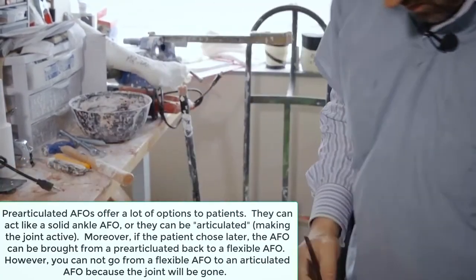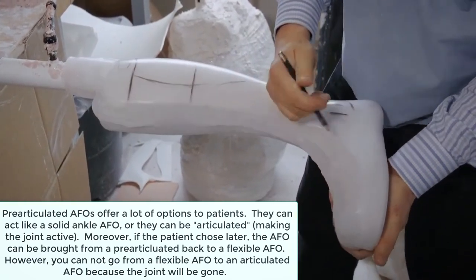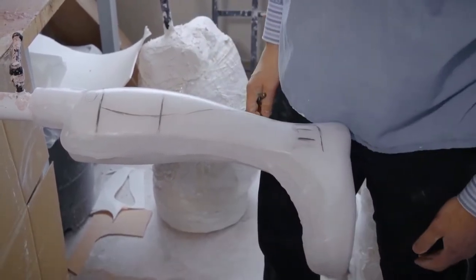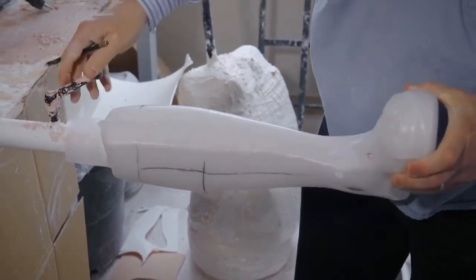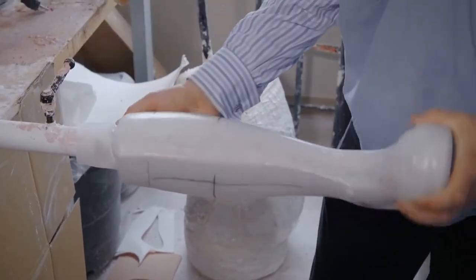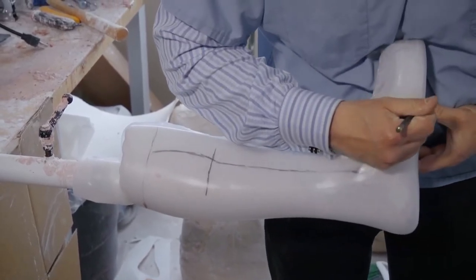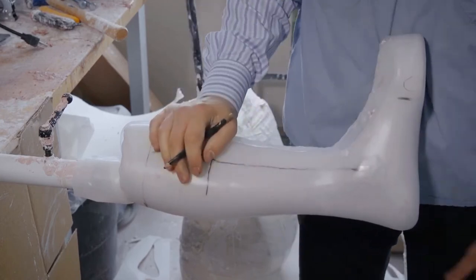Now, there are bones all throughout the foot. It's kind of amazing how many bones there are. So what an orthotist will typically do is, there's a big bone right here, your first metatarsal phalangeal joint.